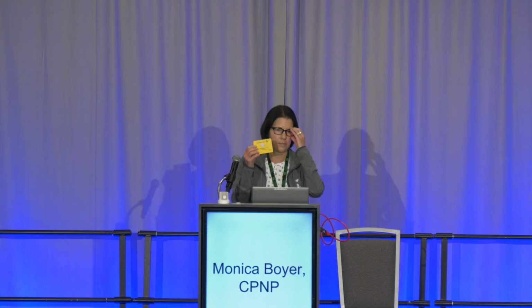As far as calibration, it can improve accuracy, and I do recommend it if the device you're using has that function. Currently, the Freestyle Libre 3 does not allow calibration. It just has internal algorithms that you need to trust. But the G7 does have a calibration feature, and I do recommend calibrating if you need it. But if, on the other hand, your device is working well, then I don't recommend calibrating. We base that decision on what we call the 20/20 rule, and I'll go over that now in this slide. So what is the 20/20 rule?